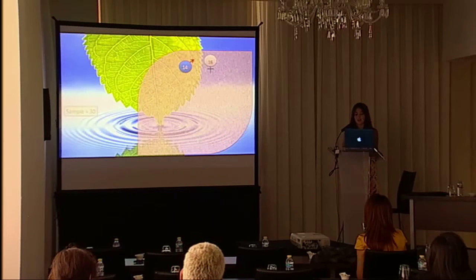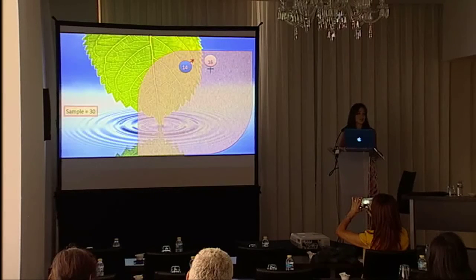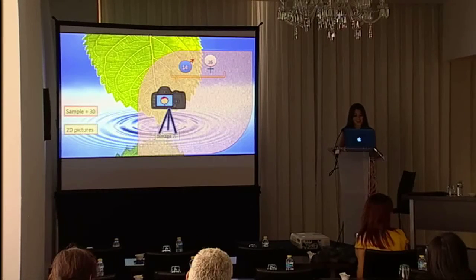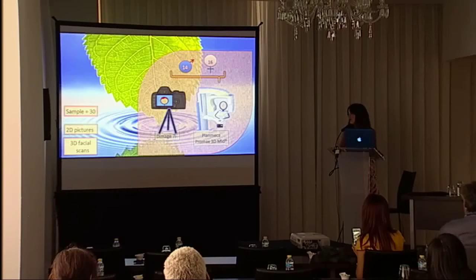The sample consisted of 30 Caucasians, aged between 25 and 50 years, with no dentofacial malformations whatsoever. To these subjects, we took 2D pictures with a classical digital camera and 3D facial scans with a 3D imaging device.